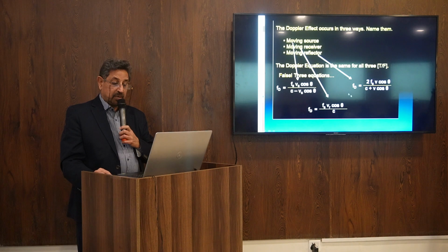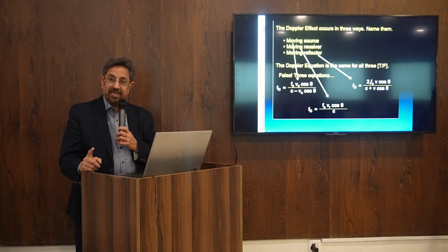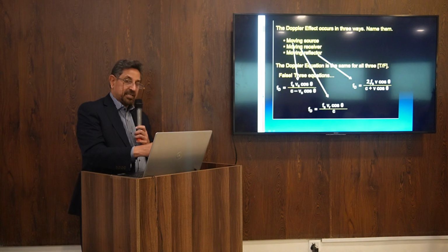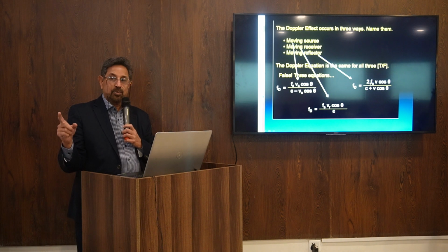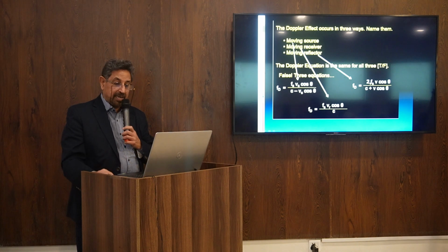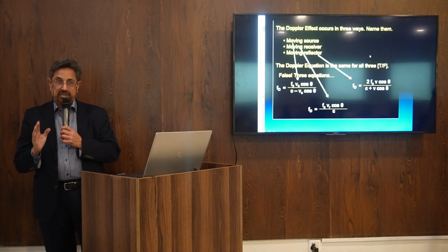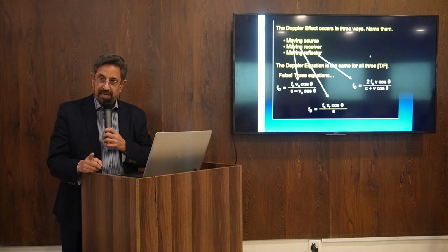This picture is for Doppler because here is written 2F, and 2F means, because we are dealing with the reflected beam, the ultrasound beam is coming from the probe to the vessel and coming back to the transducer. It has to travel double the distance. That's why it is having 2. And this cos theta will come everywhere. You can't leave this cos theta. If you don't understand cos theta, you can't understand Doppler, I tell you.